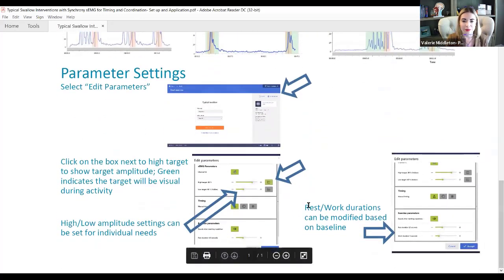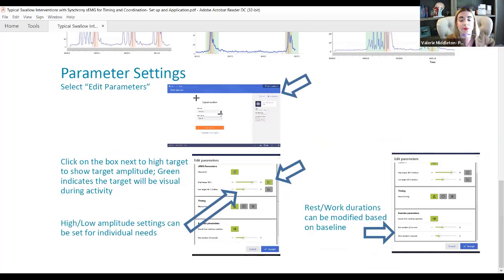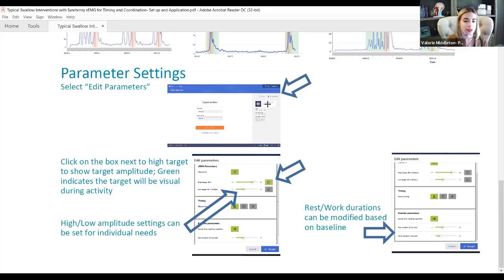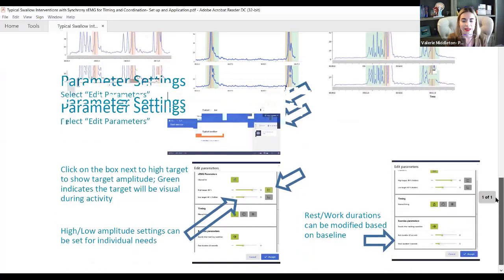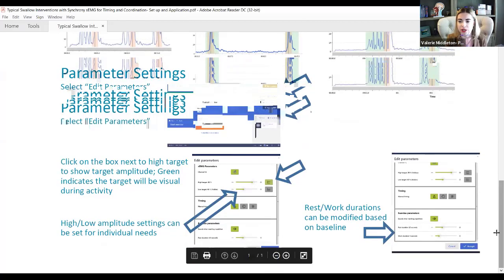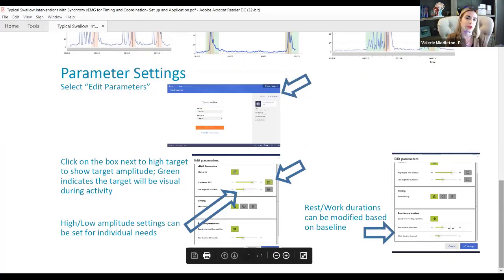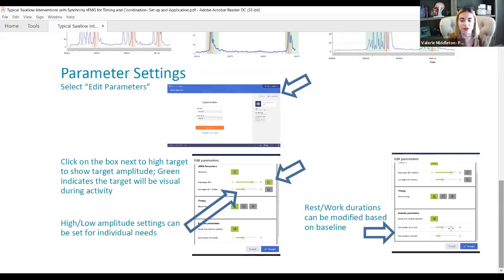There are ways to manipulate these parameters in Synchrony. We can choose the typical swallow intervention and change the visualization — it defaults to trace display, but you can change it to bow and arrow or work-rest cycle. If working on high and low targets for different pressures, you can edit the high and low target parameters, such as the 80% and 40% thresholds. We also have the opportunity to change rest and work cycle times, which is the key parameter for both swallow duration and swallow timing onset delays. This is applicable to both bow and arrow and the work-rest cycle.